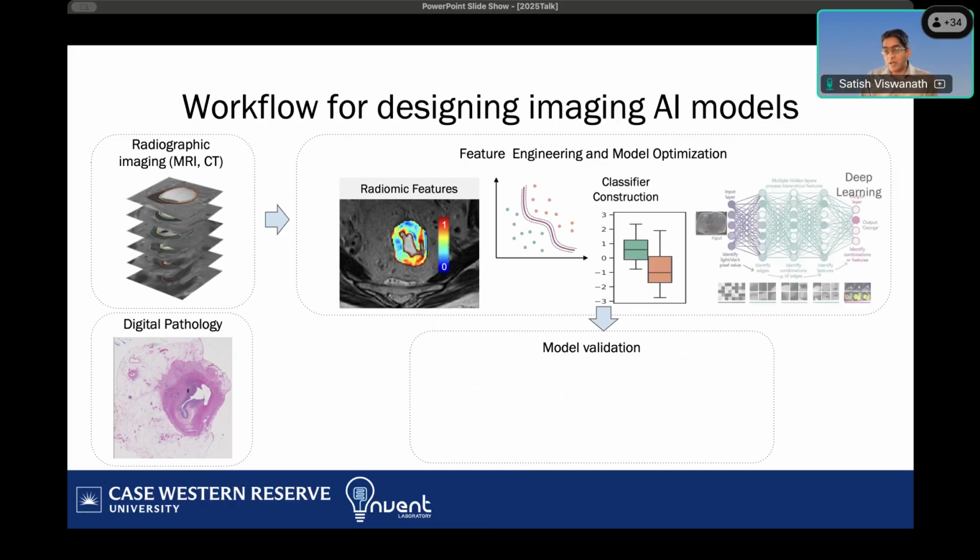We could also use the deep learning approach. Deep learning would take these exact same images, but instead of extracting the features and then building a model, it takes a much more integrated approach. So you have this multi-layer neural network, the image goes in, gets broken down into a number of different components so that it will come up with the final classification.